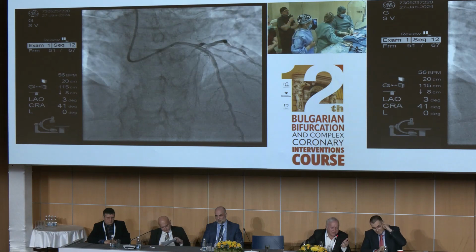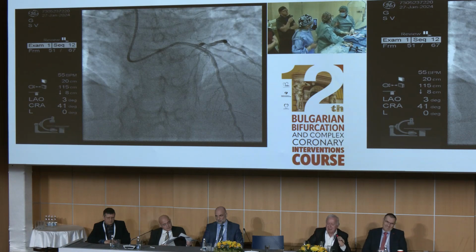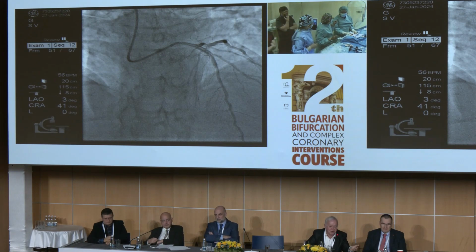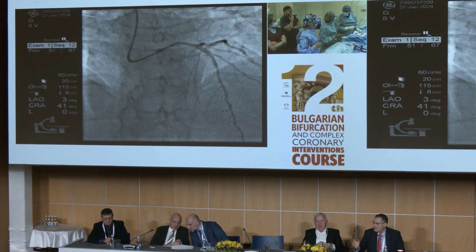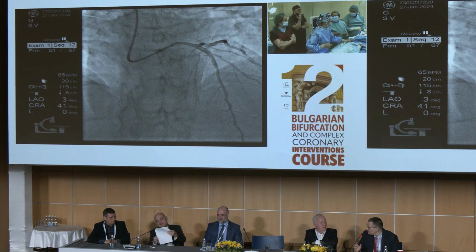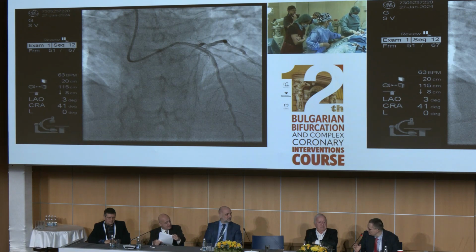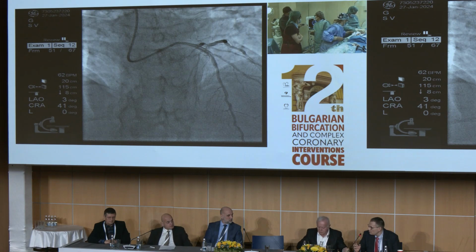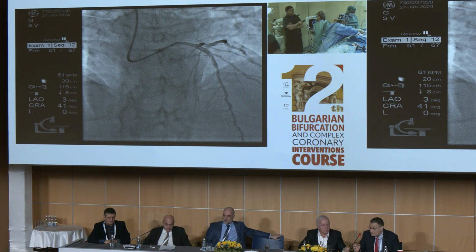Of course, it's not forbidden to inflate a fourth time, or even a bit longer. 12 is okay. But if you do the puff and you see something, normally you're supposed to do more. We can use the 4.0 we used recently. Exactly like with IVUS, if we see a malapposition, you use a bigger non-compliant balloon. Another point is that the best is the enemy of the better, and probably we should not be extremely aggressive, because the next step, trying to improve, could cause some complication.